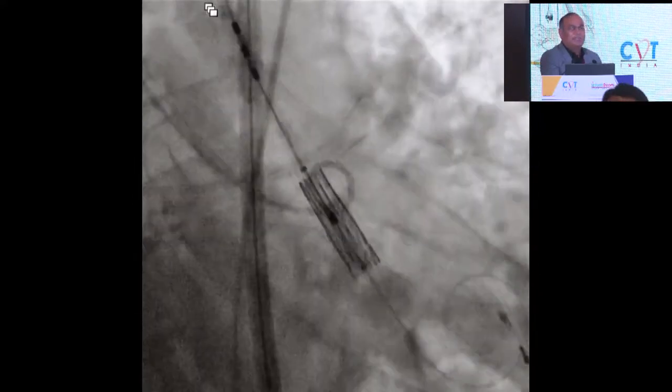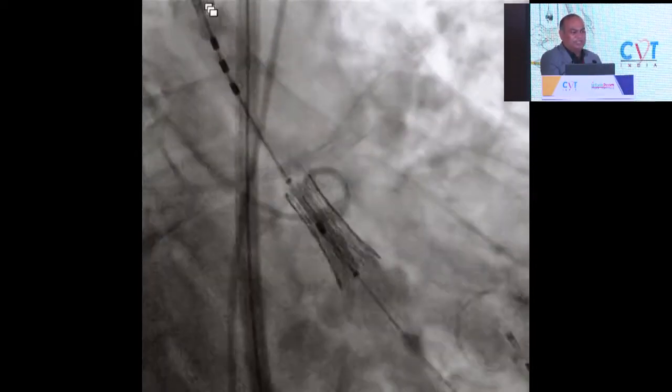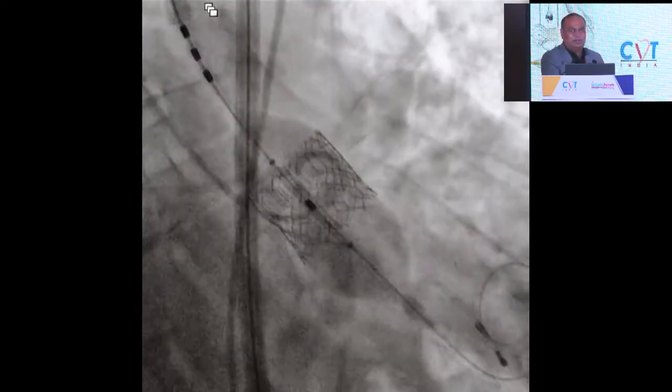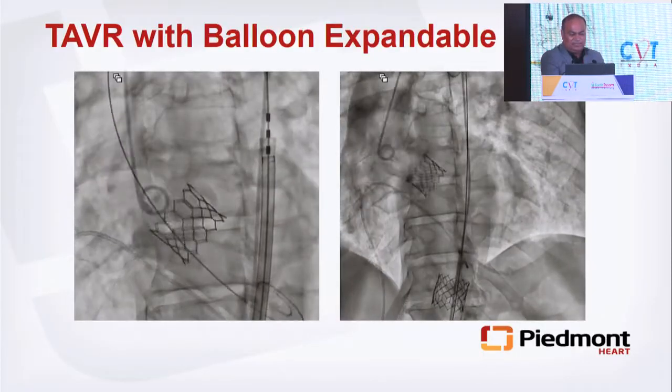This was a morbidly obese patient, right? BMI of 45. So with respiration, you see a lot of movement up and down. So sometimes when the movement is happening up and down, you have to time it with the respiration. But anyways, the second valve, we were able to land it in place.